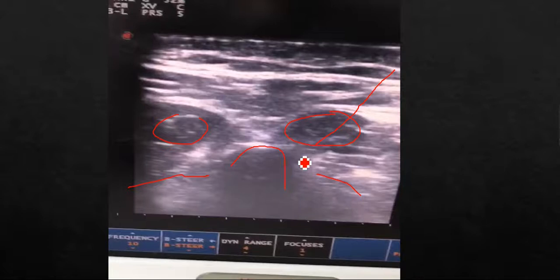Just right there until you hit the bone, and you'll feel that your needle hit the bone of the spinous process. Using diagnostic ultrasound, you will be very accurate and you will ensure that you're not too superficial or too deep, so you get better response and more accurate results. This was needle electromyographic testing for paraspinal muscles using the blind technique and using the ultrasound-guided technique.